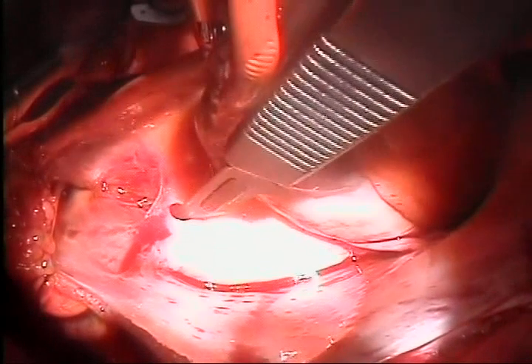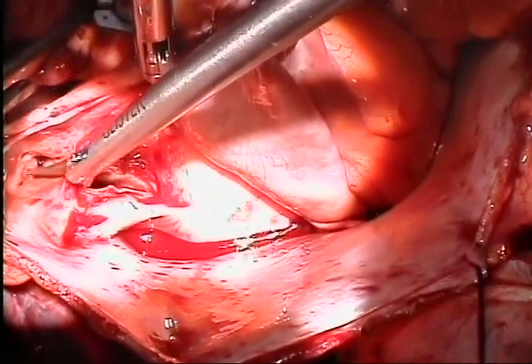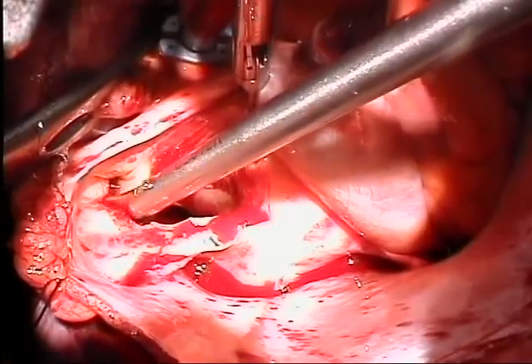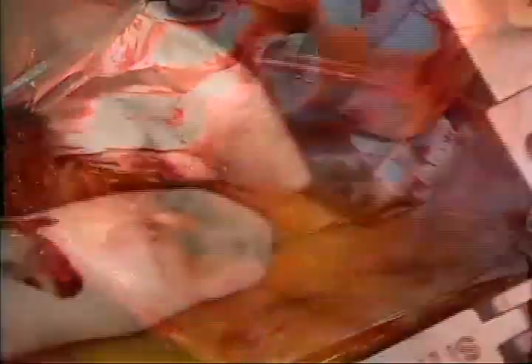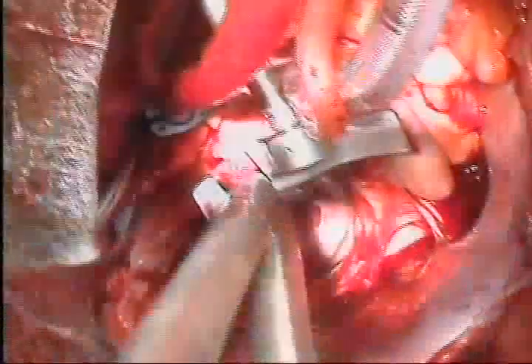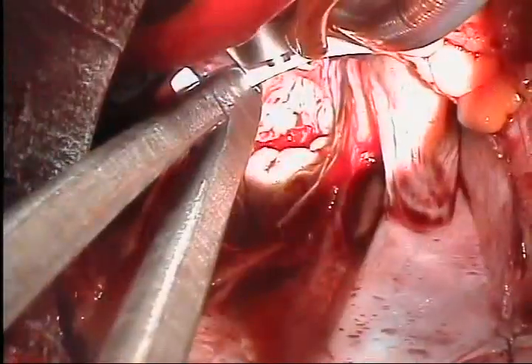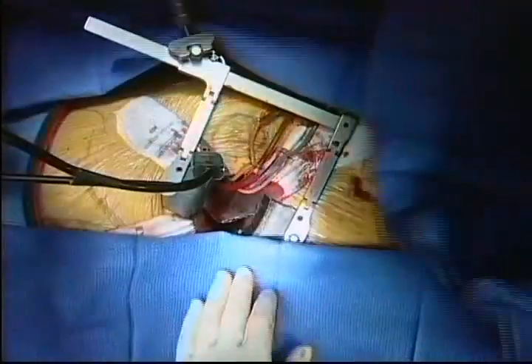The left atrium is opened anterior to the pulmonary veins, and this incision is extended behind the superior vena cava and then caudally behind the inferior vena cava. If exposure is challenging, the incision may be carried toward the mitral annulus at the caudal extent. A stab wound is created medial to the nipple in the fourth intercostal space. The crossbar of the atrial lift retractor is introduced, and an appropriately sized blade is chosen, placed in the left atrium, and screwed onto the crossbar. This is then distracted with a special retractor, and the mitral valve is visualized.